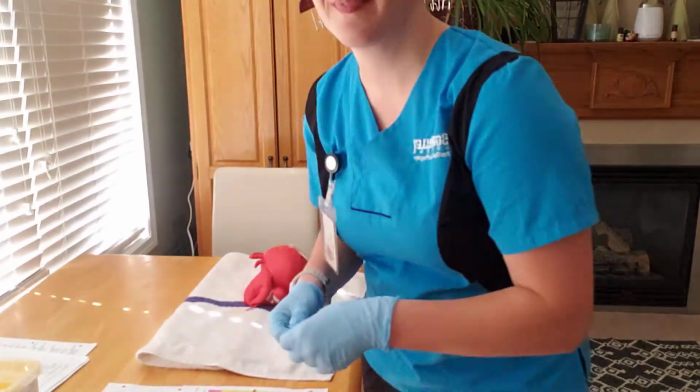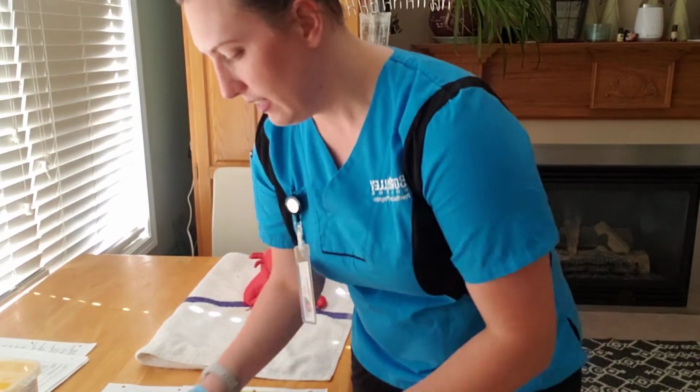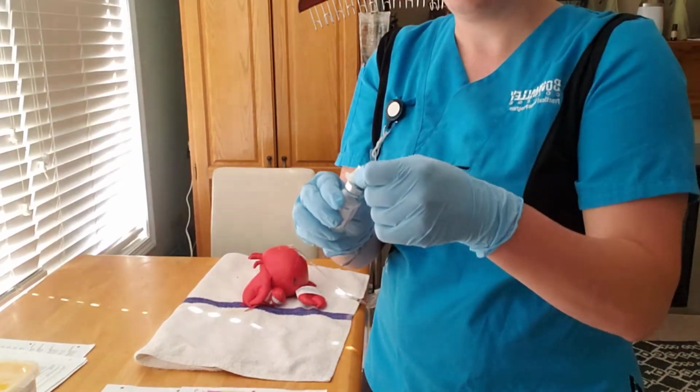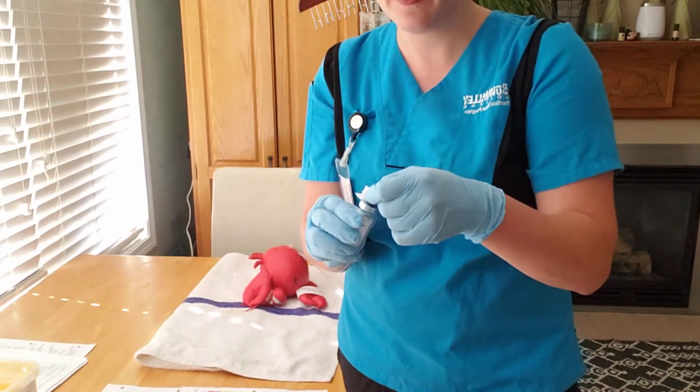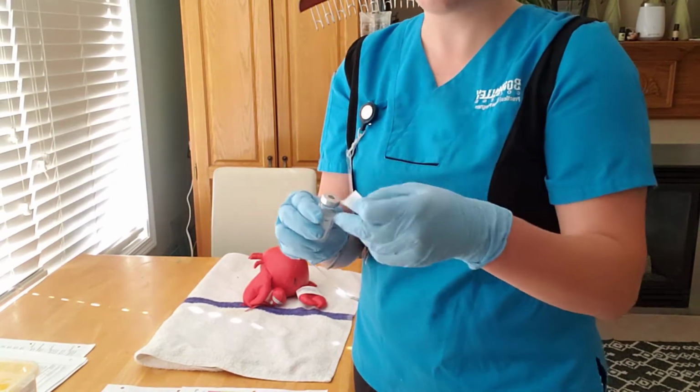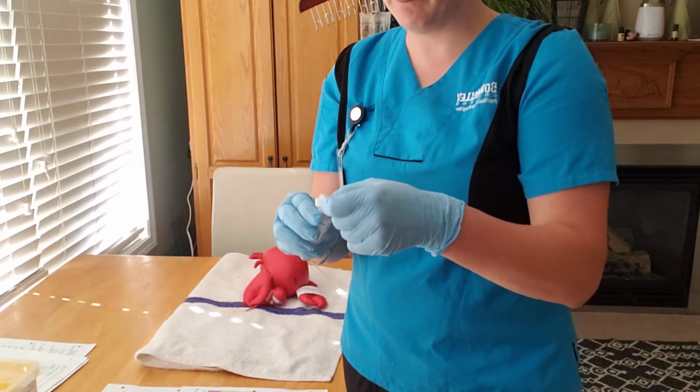Okay. We need to scrub the hub on our vial. Okay, so before I can inject that air, I need to clean my hub. So that's what I'm doing now for 30 seconds. Vigorously rubbing.